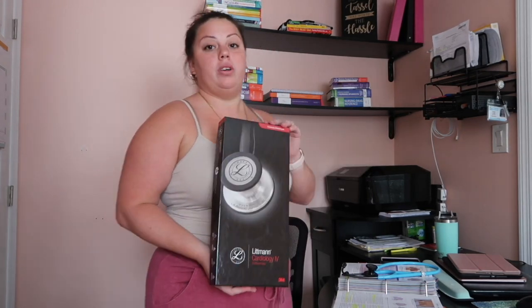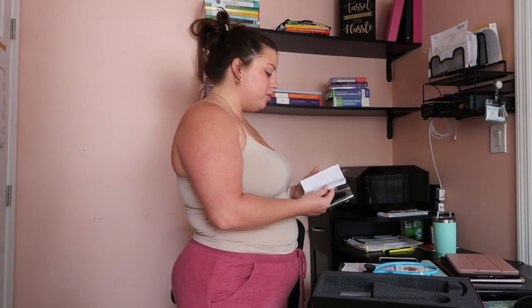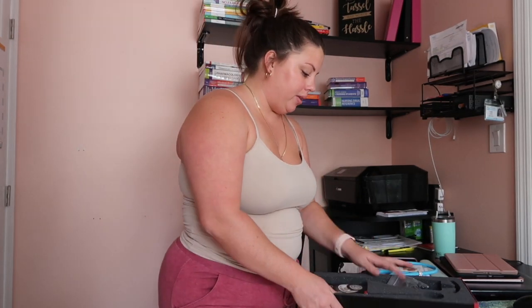I was fortunate enough to get my cardiology stethoscope — it was a birthday present. This is the box it came in. Inside it has a little pamphlet that tells you how to use and clean the stethoscope, and you also have extra parts like different earpiece sizes.